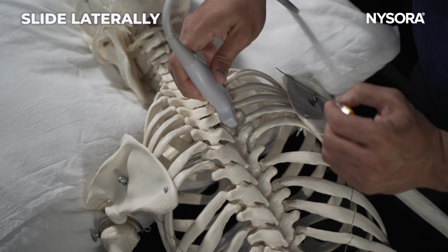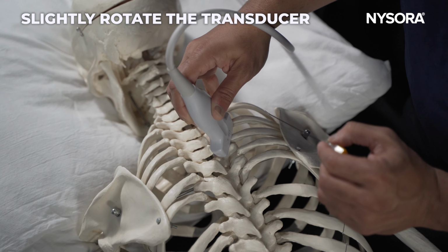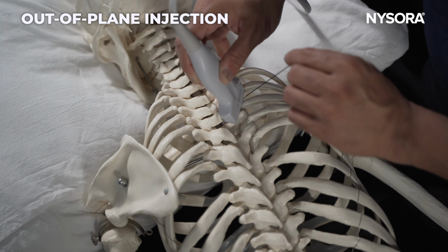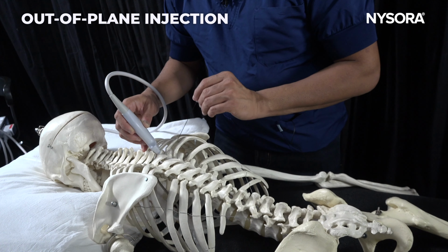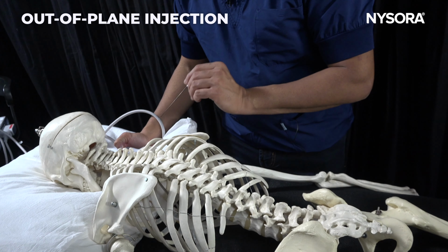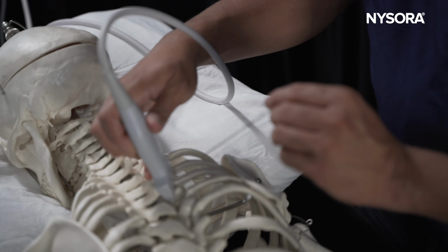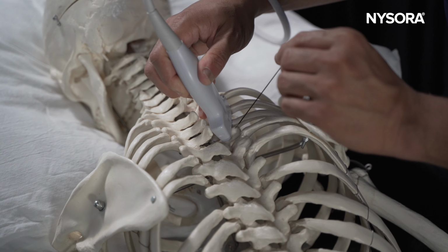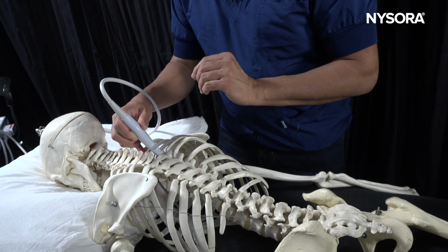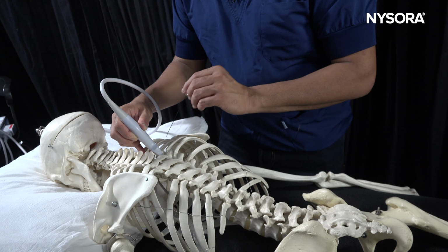Once you have located this gap, the next step would be to move the ultrasound probe slightly horizontal, and you can then target or inject this joint using an out-of-plane technique. One of the ligamentous structures that are very important when you're performing this injection is the lateral costotransverse ligament, which you'll be able to identify on the ultrasound guidance. When targeting the joint with the local anesthetic and steroid, the volume would be maximum 1 ml of local anesthetic and steroid mixture using a 25 gauge hypodermic needle.